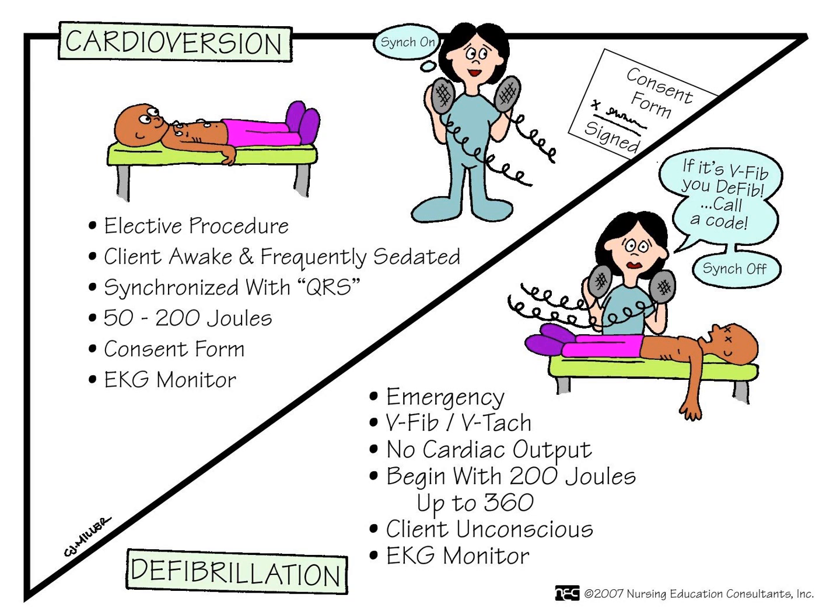Now let's also look at which patient population would undergo a cardioversion as compared to a defibrillation. Let's compare these two. Look at this patient. His eyes are wide open. That's because this is an elective procedure. Yes, they schedule a synchronized cardioversion. It is scheduled. Okay, tomorrow at 3 o'clock, the doctor's going to come by and we're going to do a cardioversion. The patient is awake, but we do sedate them, just a little bit of sedation to take the edge off of them.